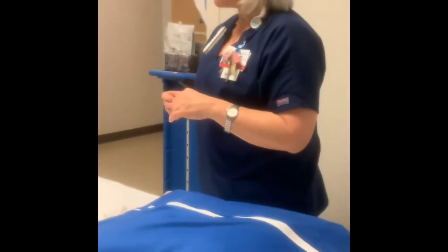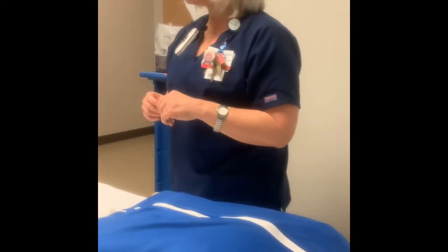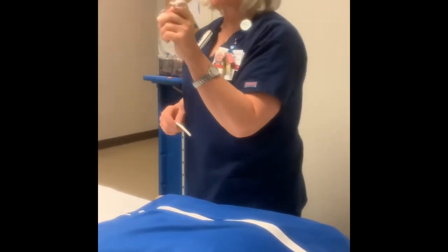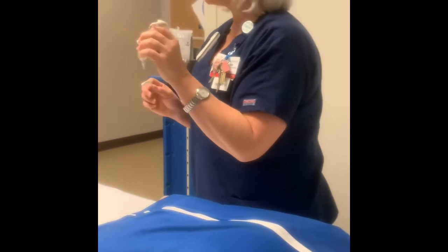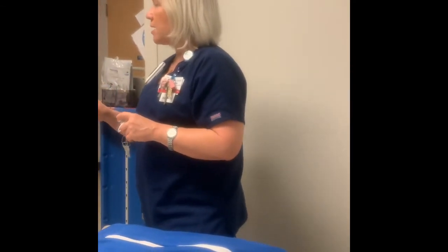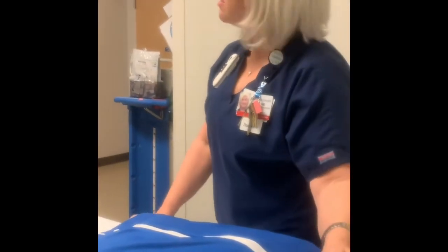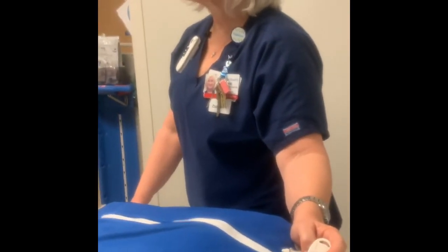And sometimes patients will come in and they may not have their obturator in. So you'll just have to call respiratory and get an obturator that will fit this size of trach. They're not one size fits all. They actually fit the size of the trach that the patient has in. And Banner's policy at Gateway is they must have one trach available at all times that is one size smaller than what's in their throat. Okay? So that's our policy here.